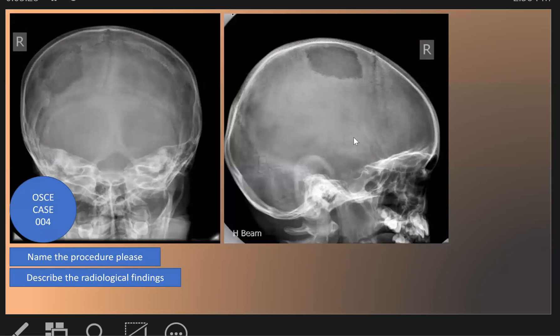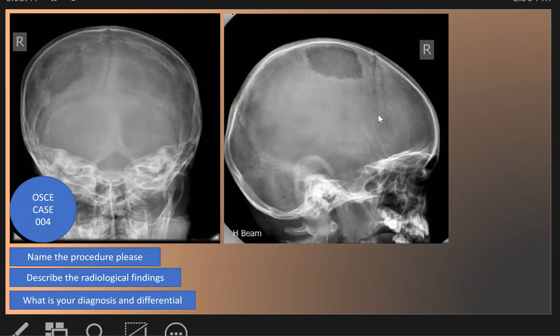This is the radiological finding: the lytic lesion — a punched-out lytic lesion with beveled appearance, or beveled sign. And what are the diagnosis and differential diagnosis? Once we see the beveled appearance, it is highly suggestive of Langerhans cell histiocytosis.